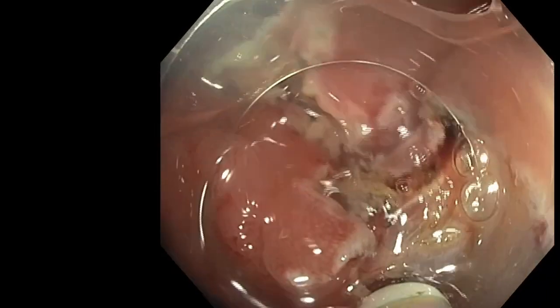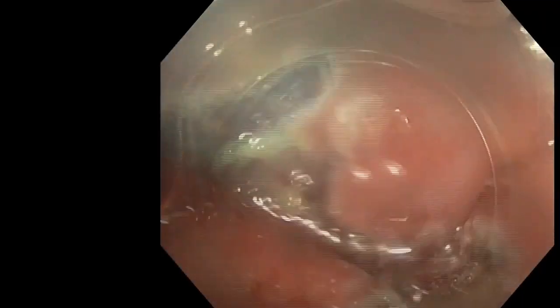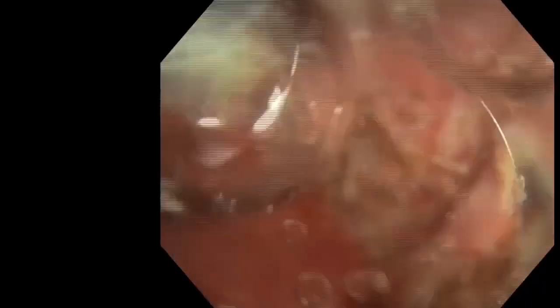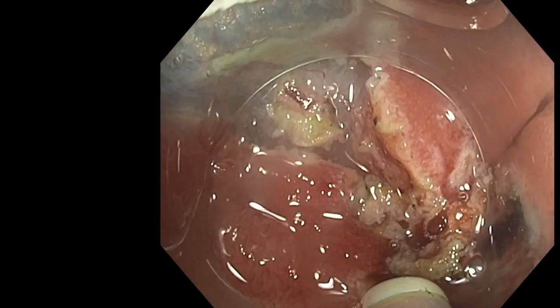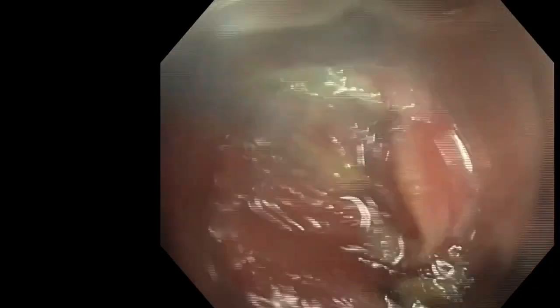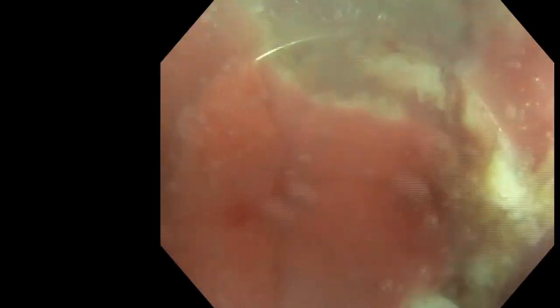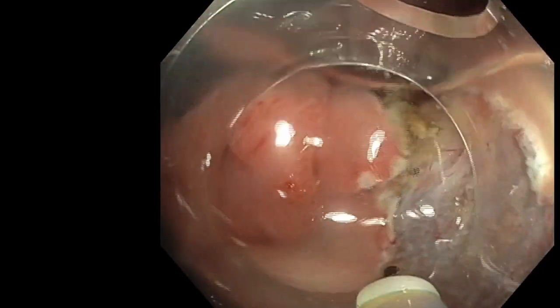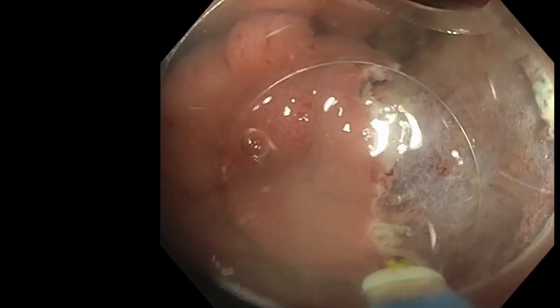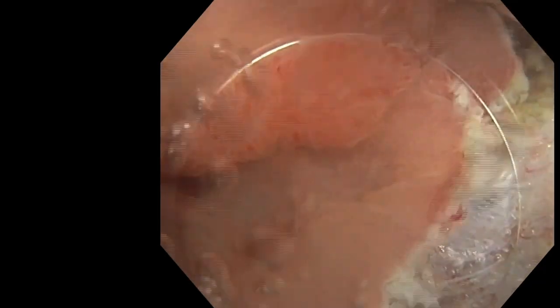And a small trick probably is that when you have a bleeding like this, you should go on and do your incision a little largely in order to make the bleeding point visible. Because the most difficult hemostasis you have is when you don't know where it comes from. So if the space is not open and it bleeds into your incision but without seeing where it comes from, please enlarge, please cut, even if there is blood, because you will save time by opening the space and seeing where it comes from.